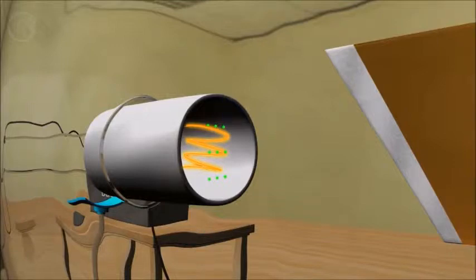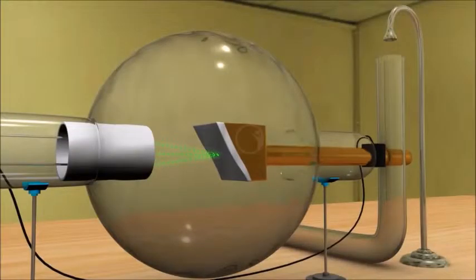The filament is surrounded by a molybdenum cylinder, which is kept at a negative potential to the filament. This repels the electrons further, and hence the electrons form a fine pencil beam at the center of the cylinder. This pencil beam is also accelerated by the cylinder towards the target.